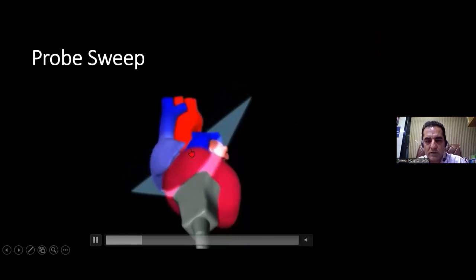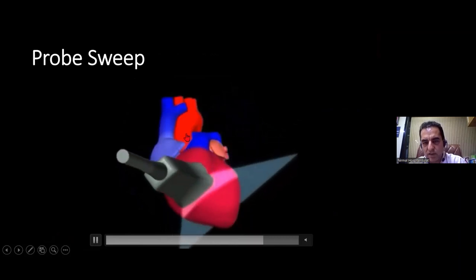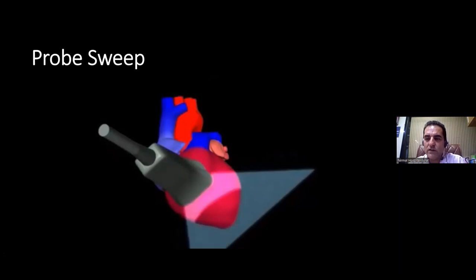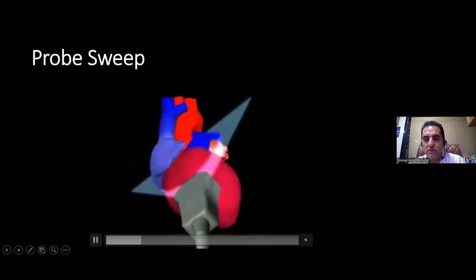We then sweep the probe from the base of the heart towards the apex. Imagine yourself as an RBC traveling through the left ventricle — you start at the base of the heart where the root of the aorta was, which is the Mercedes Benz sign view. From there, the next point of entry into the LV will be the mitral valve, so the next view will be the mitral valve view.